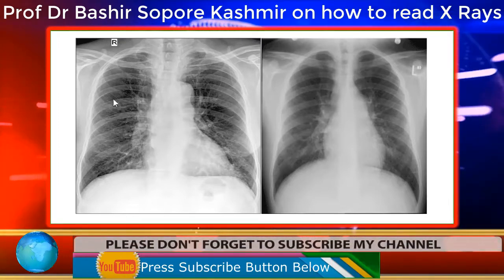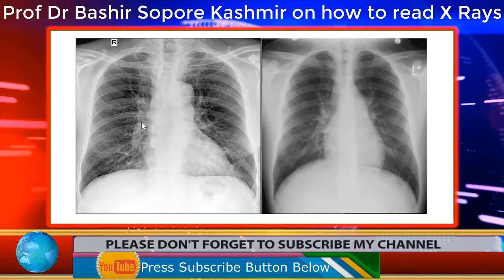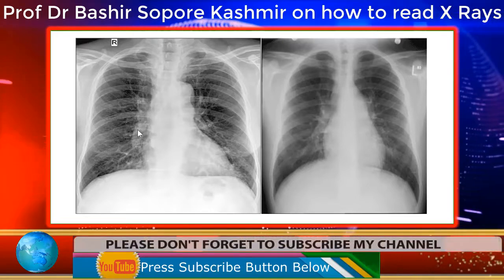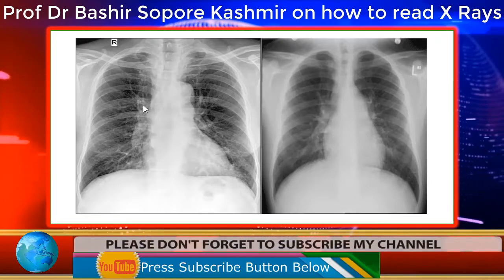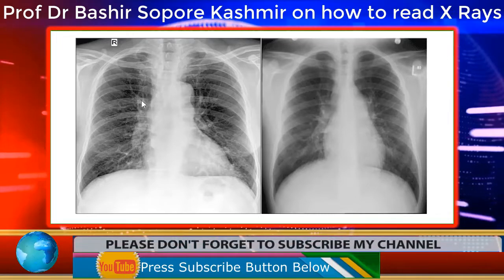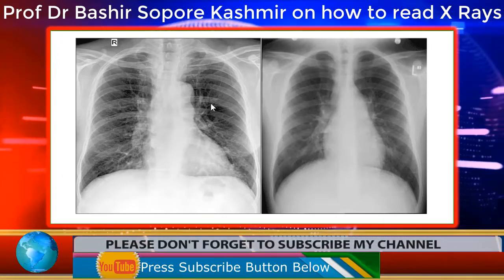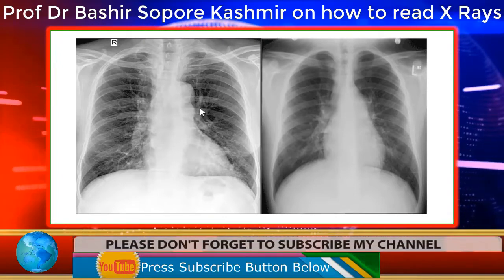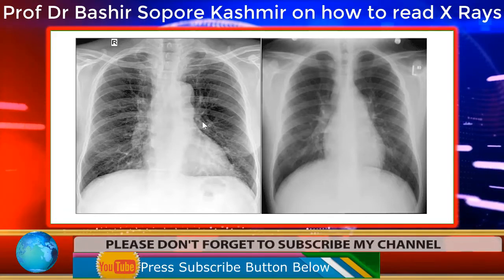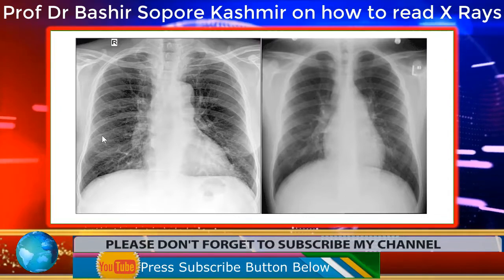These are called vascular markings, and as you already know, this will be the lower pulmonary artery. This will be the upper pulmonary artery, branches of the main pulmonary artery here, and it is slightly V-shaped here. Here also it is V-shaped. This is the upper lobe pulmonary artery, this is the lower lobe pulmonary artery. What you see here are the vascular markings.